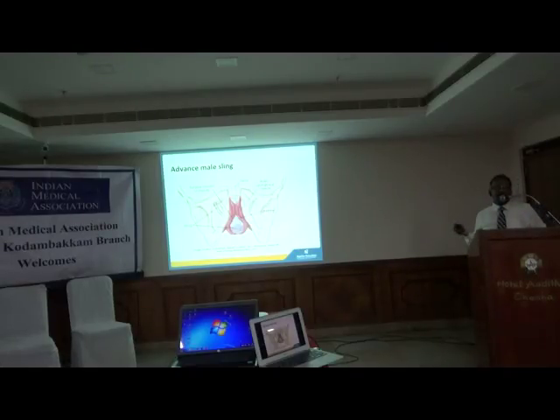This was promoted as an alternative to the sphincter because the sphincter is much more expensive. But the problem is, if it's too tight, the patient may not be able to pass urine. If it's too loose, it doesn't serve the function.